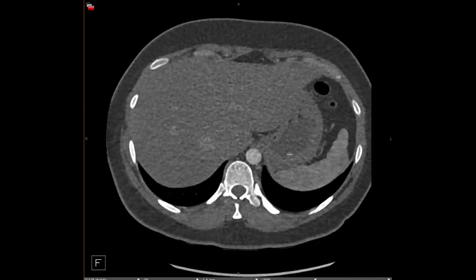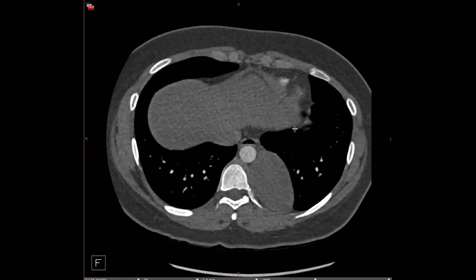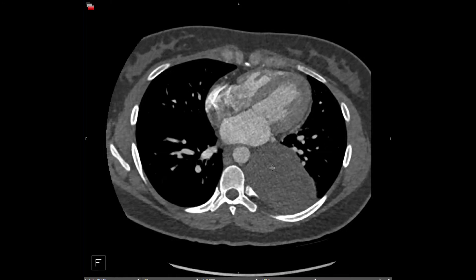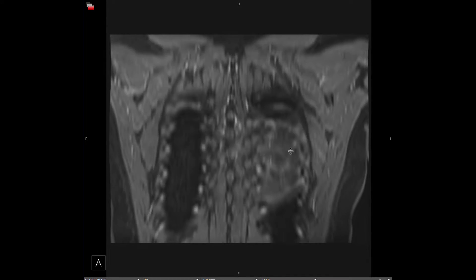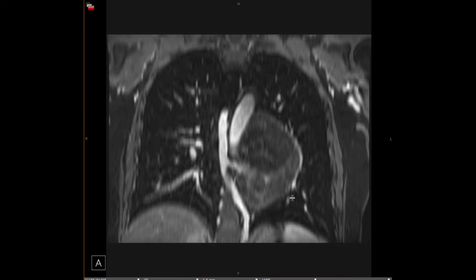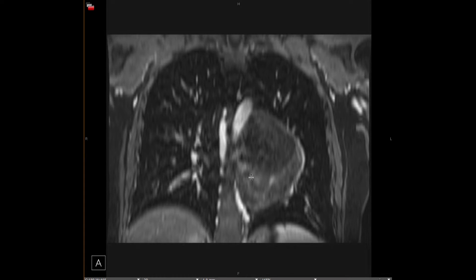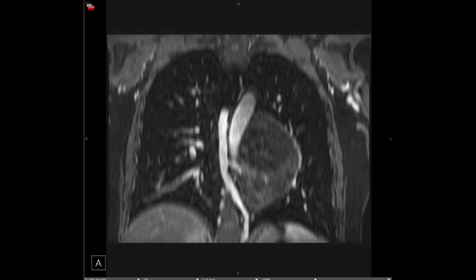Either kind of sequestration can have systemic feeding vessels from the upper abdomen, so it's important to look for feeding vessels there — sometimes they'll have multiple feeding vessels. This case does not have abdominal feeders, but you can see this very mass-like lesion has systemic arterial supply. This was actually an extralobar sequestration. On MRI, you can see there is a draining vein to the azygos system here.